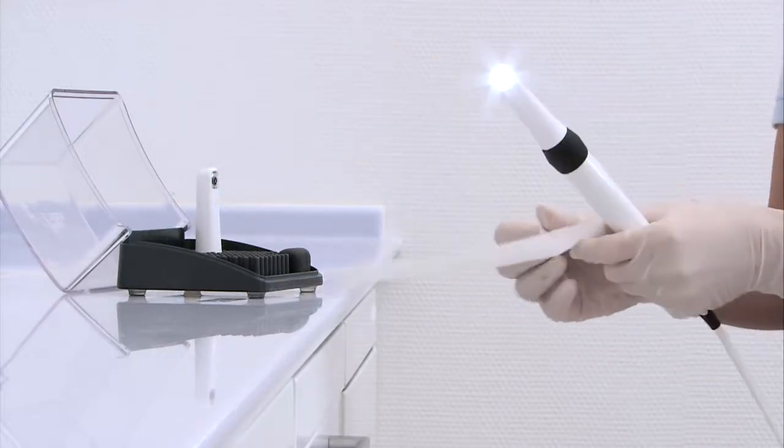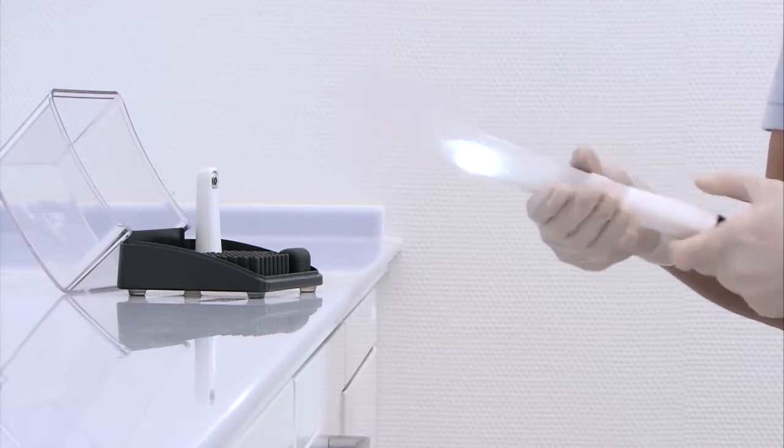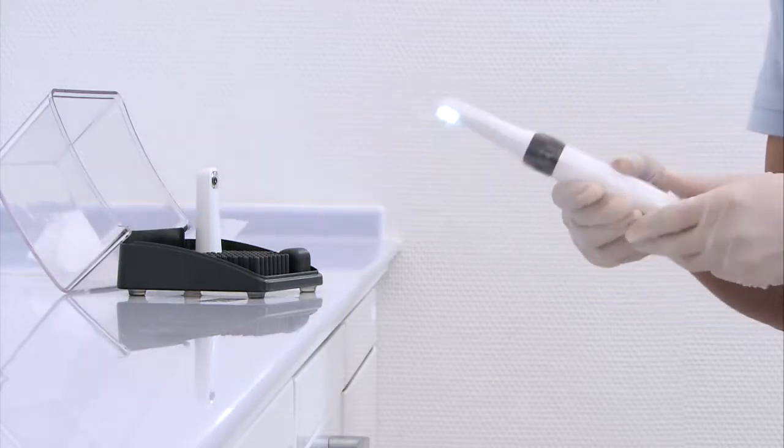Disposable protective sleeves have proven their worth as a sensible way of preventing infection. Alternatively, a quick disinfection method can be used, for instance FD350 disinfectant wipes by Dürident.